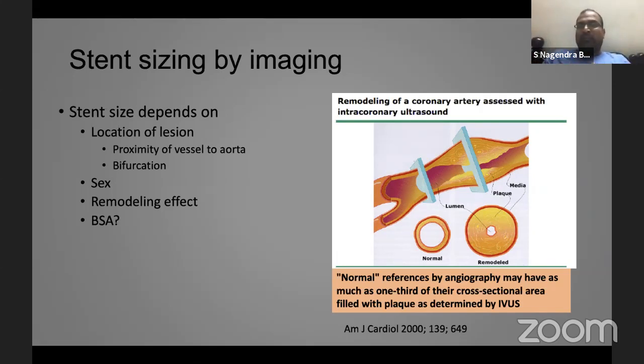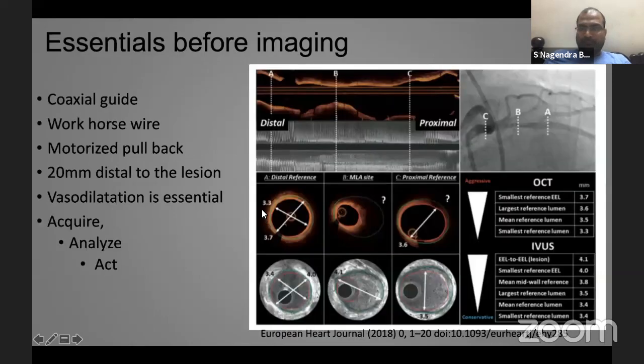That is plaque burden. When we say plaque burden, it's not a big terminology. It's the amount of plaque that is inside the particular segment of the vessel, occupying the particular cross sectional area of the external elastic membrane. That is plaque burden. So in order to define remodeling, let's go into the next slide. I will discuss remodeling in the forthcoming slides.